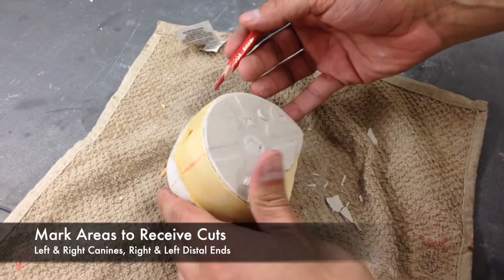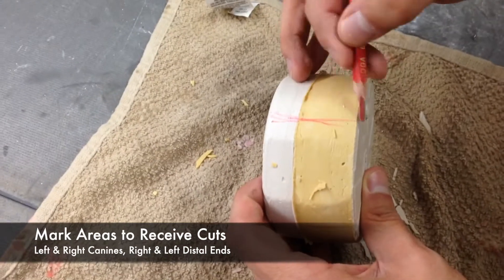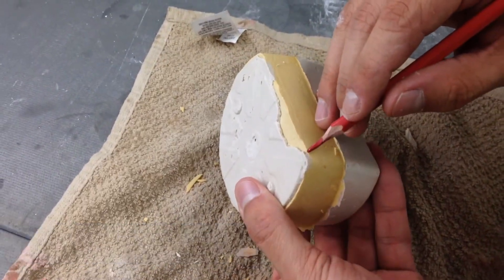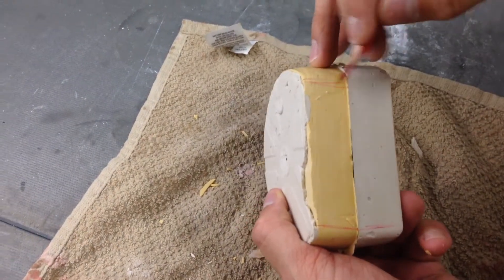Next, mark your areas for your right and left canines and your right and left distal ends of the stone investment. These areas are designated as where you will be placing cuts with a plaster saw later on.